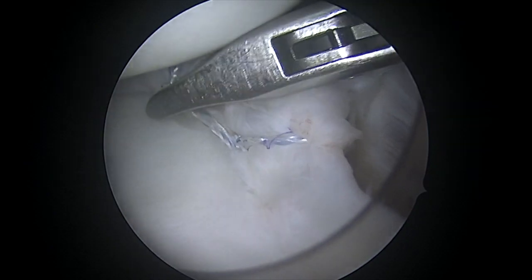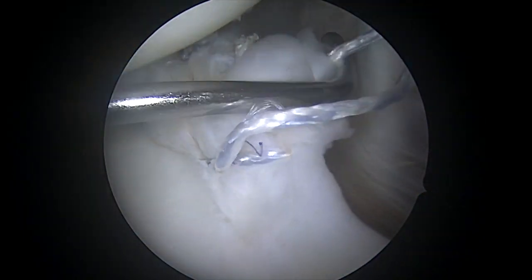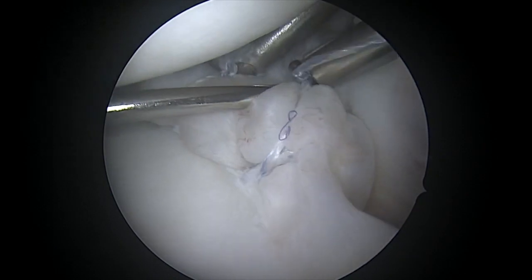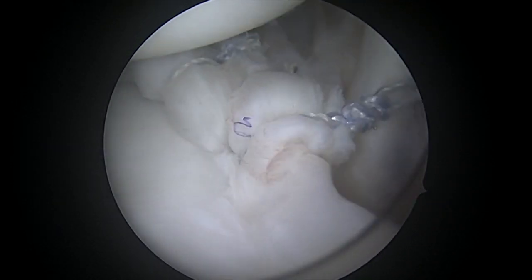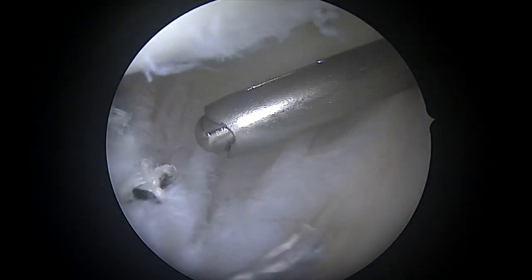One of the things that's problematic here at the very top is that the knot can't always be exactly where I want it. So one trick we'll use is this instrument called a probe from the back to reorient the suture and get it around the maximum amount of tissue possible. When I pull down, you can see that reorients the knot to pull the maximum amount of tissue up onto the socket. I'm quite happy with that. You can see we have a nice bumper at the front edge of the socket, and I'll test the tension within the ligaments with our drill guide — that looks quite good, and we're done. Thank you so much for watching my video.